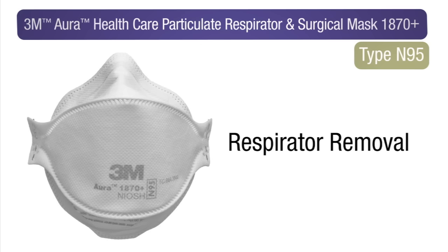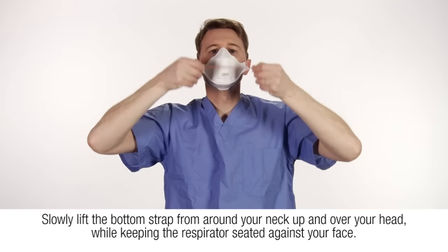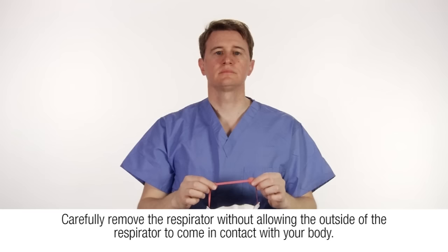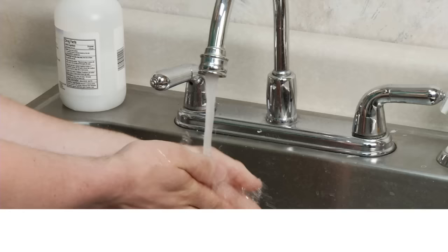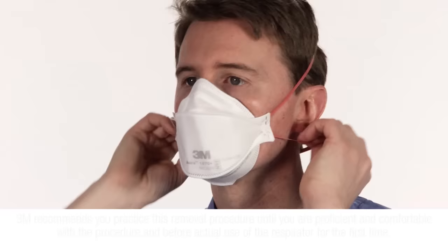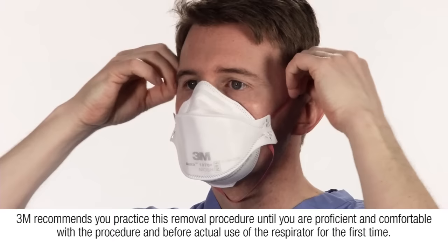To properly remove the respirator, do not touch the face piece. Slowly lift the bottom strap from around your neck and over your head while keeping the respirator seated against your face. Lift off the top strap. Carefully remove the respirator without allowing the outside of the respirator to come in contact with your body. Perform hand hygiene.